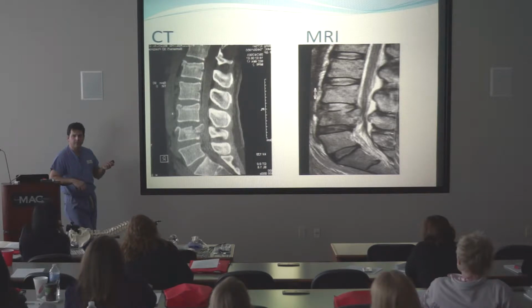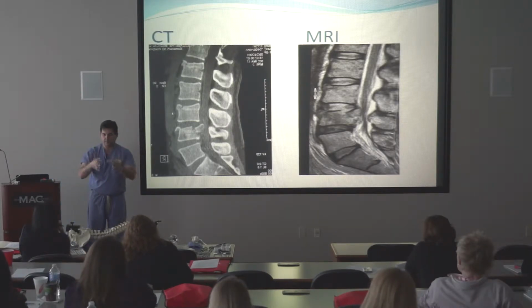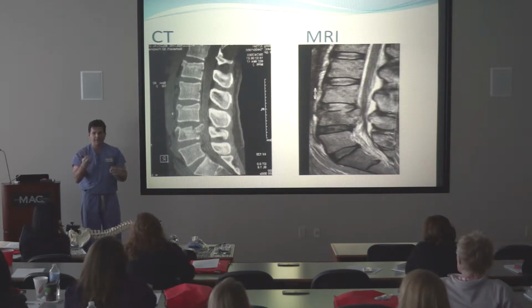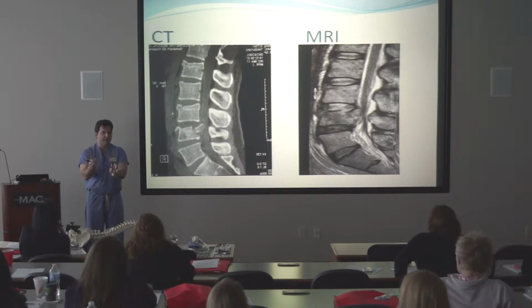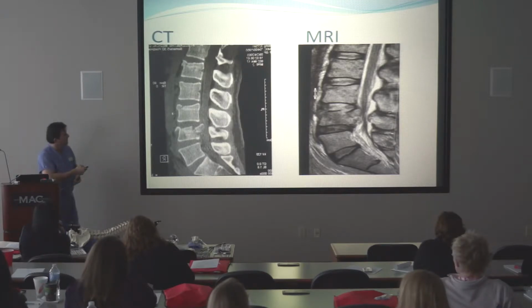Do you guys know how the MRI works, by the way, as far as the technology of that too? With that magnetic field, there are hydrogen atoms that are attached to all the different molecules in our body. The way they're attached to the molecule, they have certain angles of attachment. When you turn a magnet on, as powerful as these magnets are, those hydrogen atoms go into a certain alignment. Then they shut the magnet off. Those hydrogen atoms then go back to where they were. When they do that, they actually release energy. And that MRI machine picks up that energy that's being released, and the computer once again interprets that information into an image. So that's how you get the pictures.